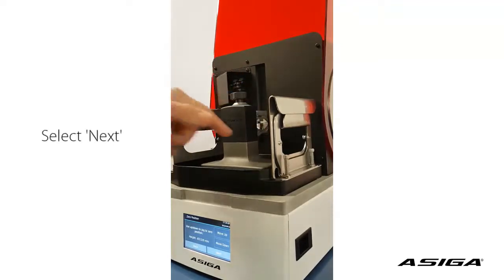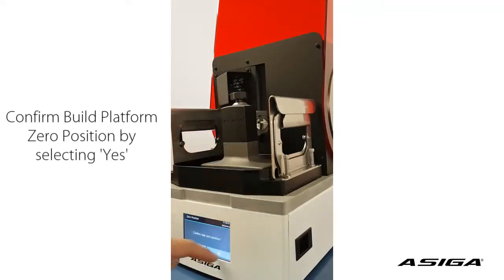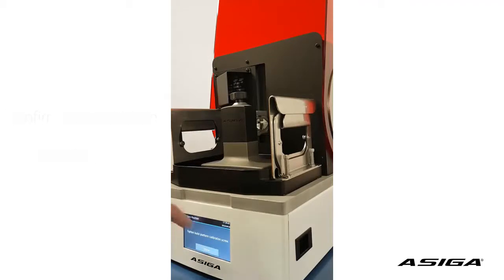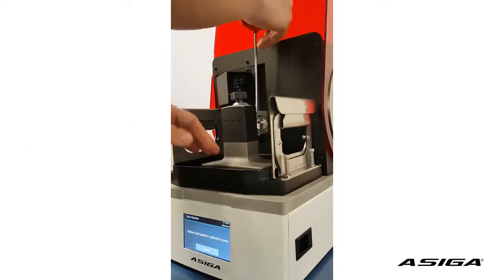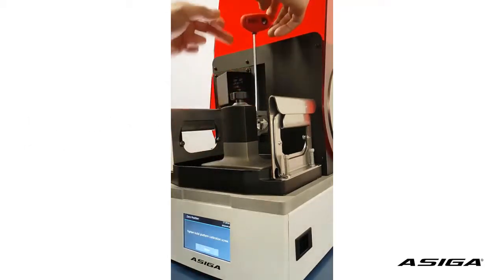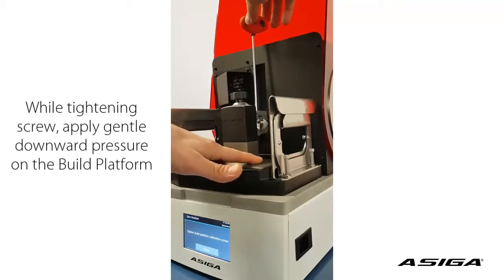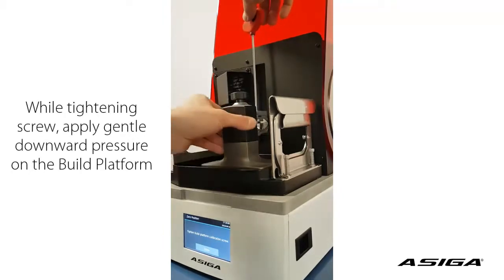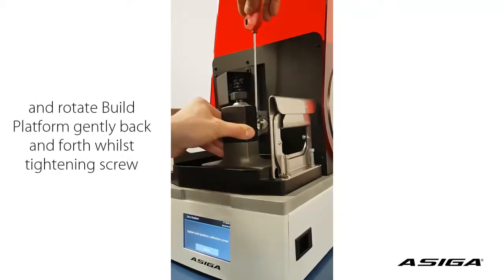Now we confirm the zero position. It tells us to tighten the build platform calibration screw, which we will do. This requires special attention. We place the screwdriver onto the screw and turn it clockwise while pushing down the platform and slightly rocking the platform — pushing it against the glass.